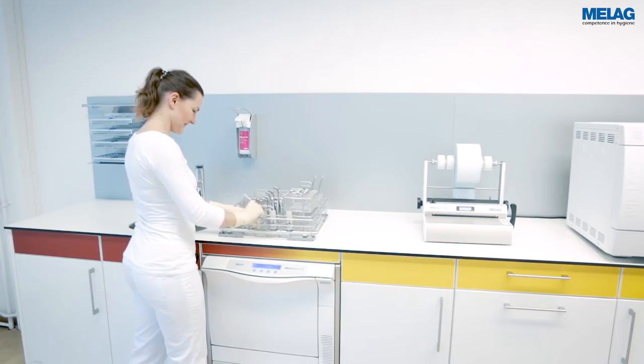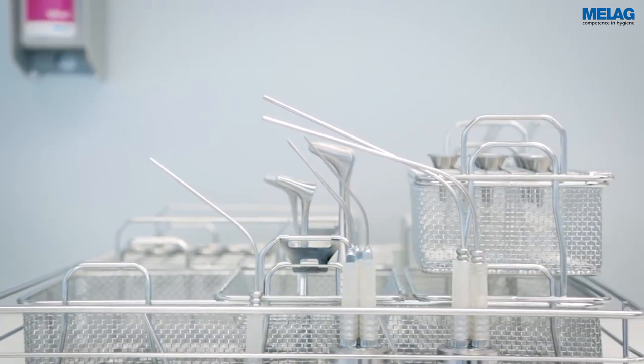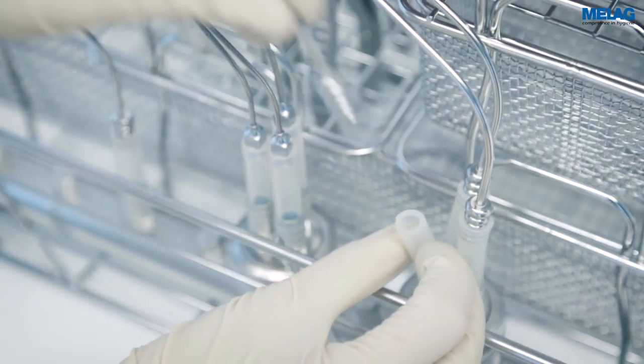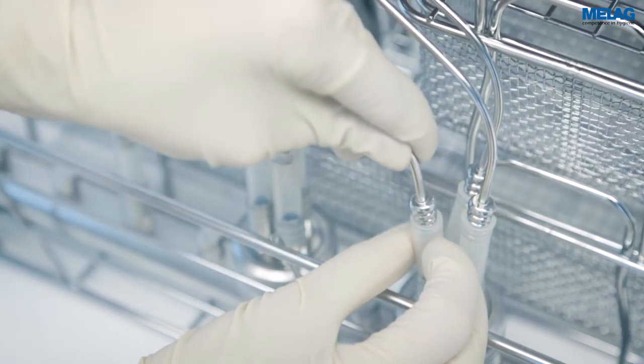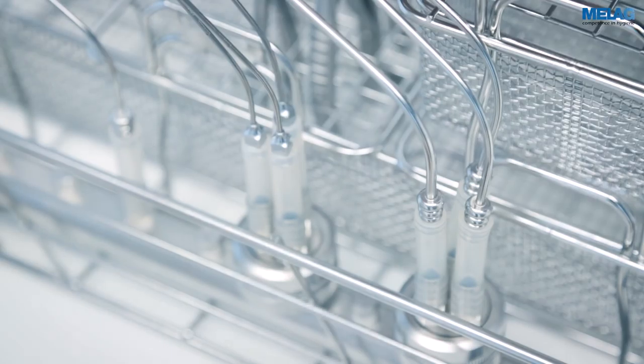The injector rail ensures the reproducible decontamination of hollow body instruments. Suction tubes are connected via a silicone hose. A triple distributor is available in order to connect a greater number of suction tubes.